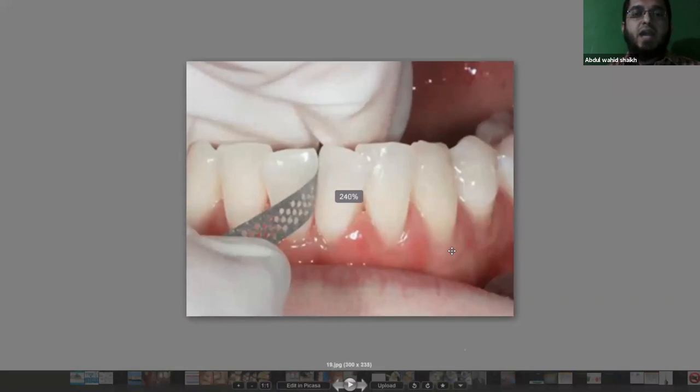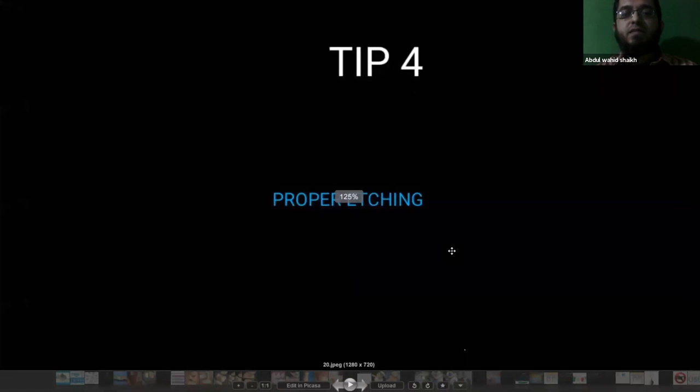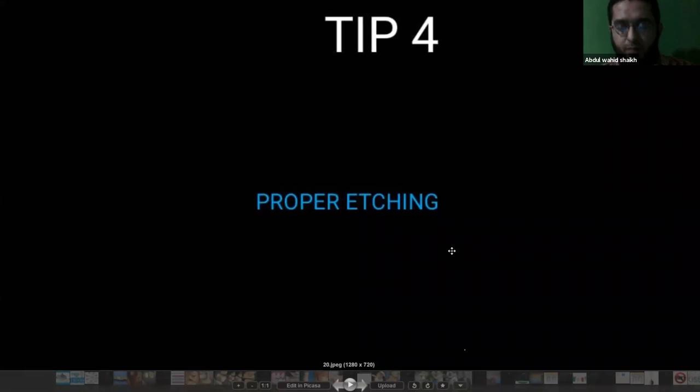For interproximal spaces that polishing cups and brushes can't access, we use abrasive strips. We should be very judicious with our movements using the strips — we are only trying to remove the soft plaque, not remove enamel or change the shape of the tooth.